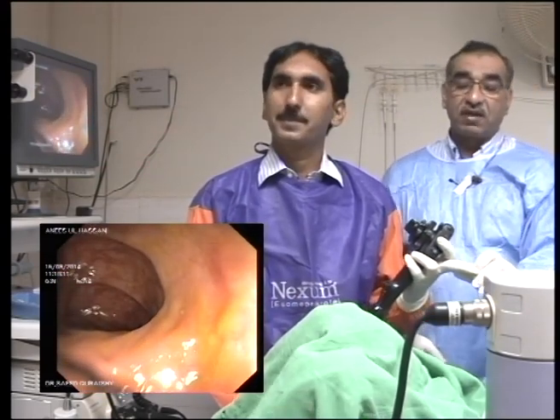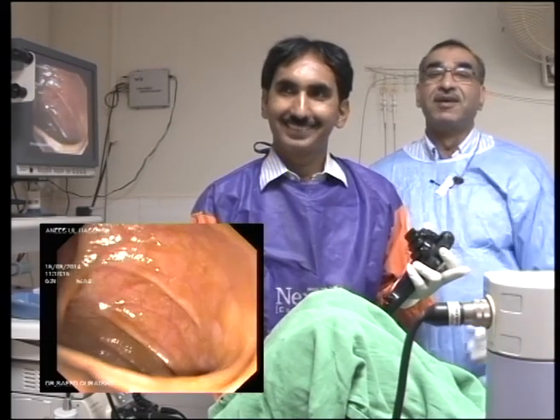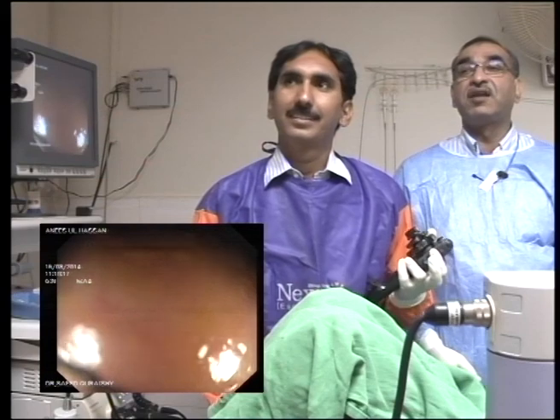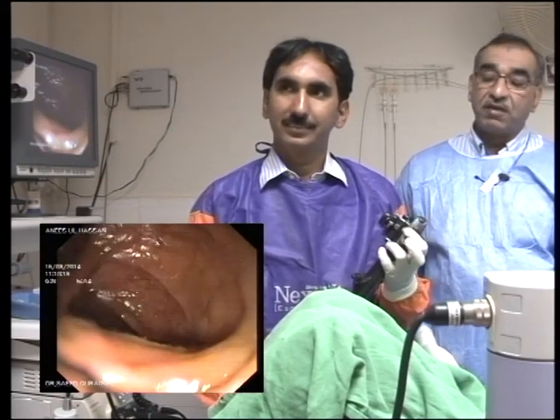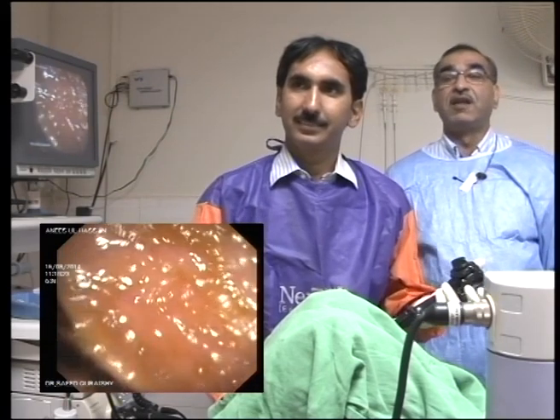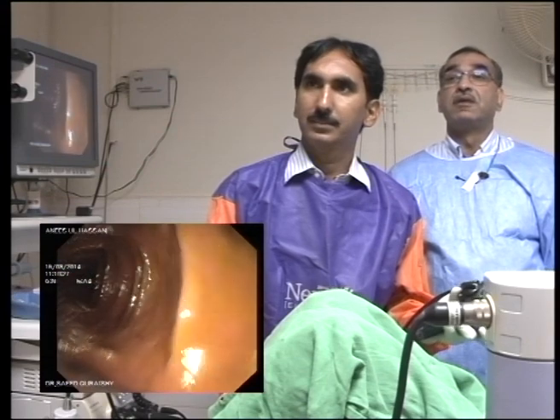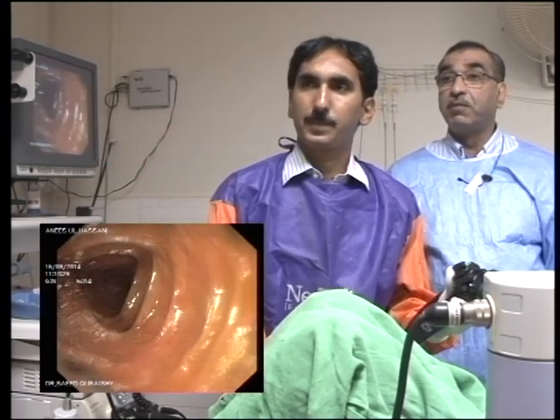I'm just holding his middle finger because he's got a bad habit of overinflating the patient. Yeah, I was looking at that. Yes, we can see that here. That is why he has been burping up wind from his mouth. And if you see that, that means you are seriously overinflating your patient. Okay, that's good. Keep going.